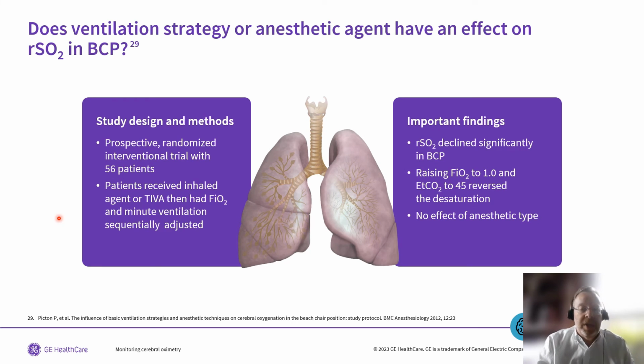What they found was that regional saturation declined significantly when these patients were placed in beach chair position. Raising the FiO2 to 100% oxygen and allowing permissive hypercapnia with the end-tidal CO2 at 45 reversed desaturation in these patients. They did not, however, find any effect of the anesthetic type.